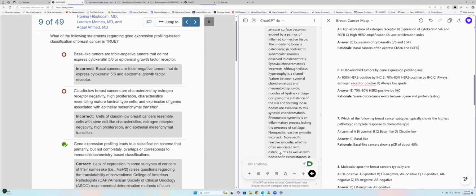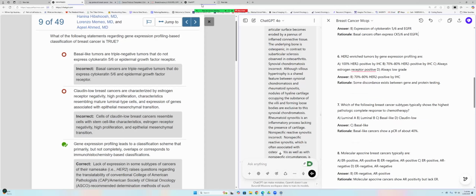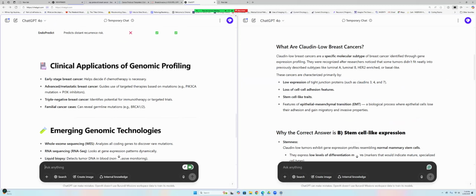Less than 10%. No, 0, negative. Yes, I agree with you. Less than 7%, but no staining. Less than 10%, but with staining. Greater than 10%, but it's okay.